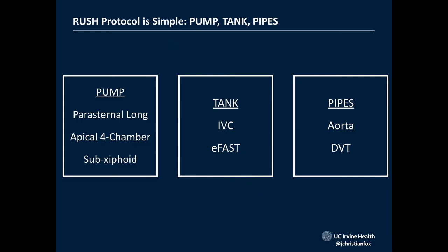So that's the rush protocol. There's a lot to it, and I know it's like I'm like Oprah Winfrey saying, you get an ultrasound and you get an ultrasound and you get an ultrasound, but when you get good at it, you could probably bust through a whole rush protocol in probably less than 5 or 6 minutes if you move the probe swiftly.